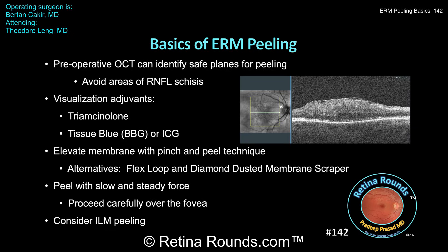When extending the peel, it's important to go slowly and use steady force, carefully looking out for excess traction on the inner retina and ensuring the forceps don't inadvertently contact the inner retina. Once peeling is done, some surgeons also prefer to stain and peel the ILM. While studies have shown visual outcomes are not different with ILM peeling, this extra step can decrease the risk of recurrent ERM formation, so the surgeon must weigh the risk-benefit of performing this additional step.